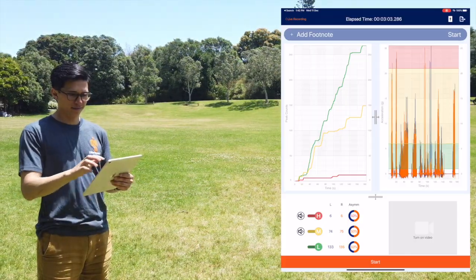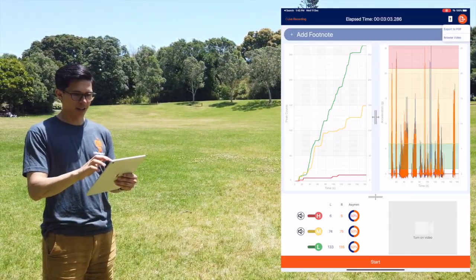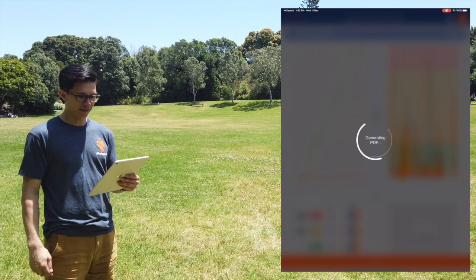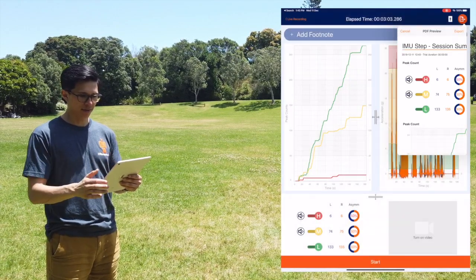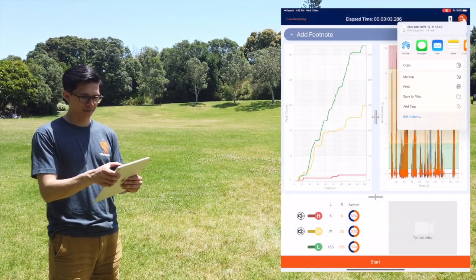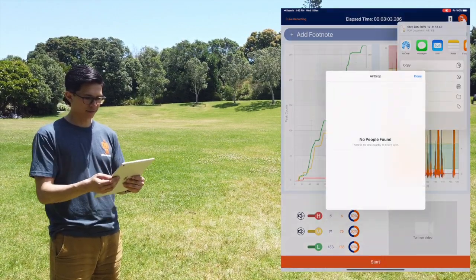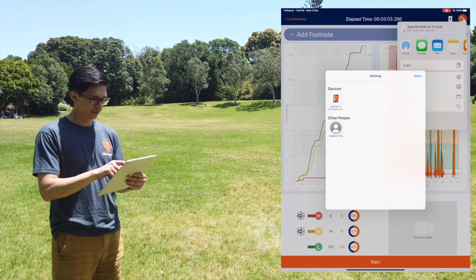To end your live recording, tap End Recording. To quickly export a PDF of your session, tap the export icon and select the appropriate method with which to send it, for example via AirDrop.